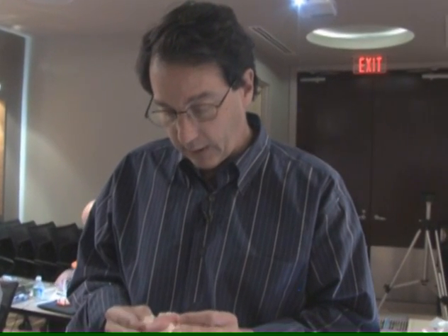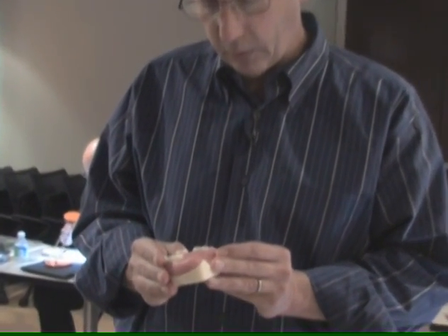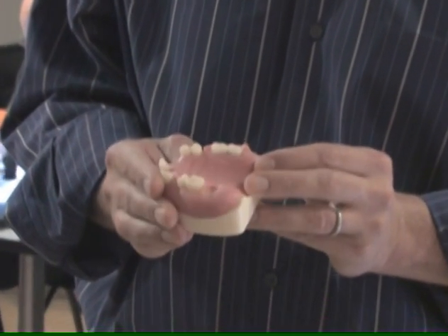So the participants are getting the opportunity to harvest a connective tissue graft with one incision, close that incision, and then place the connective tissue graft on the labial of 2 posterior molars, utilizing a coronally repositioned flap, vertical incisions, and periosteal suturing. So challenging to do in the mouth and on the model, but certainly a good experience. If you can do it on the model, then you can certainly do it in the mouth.